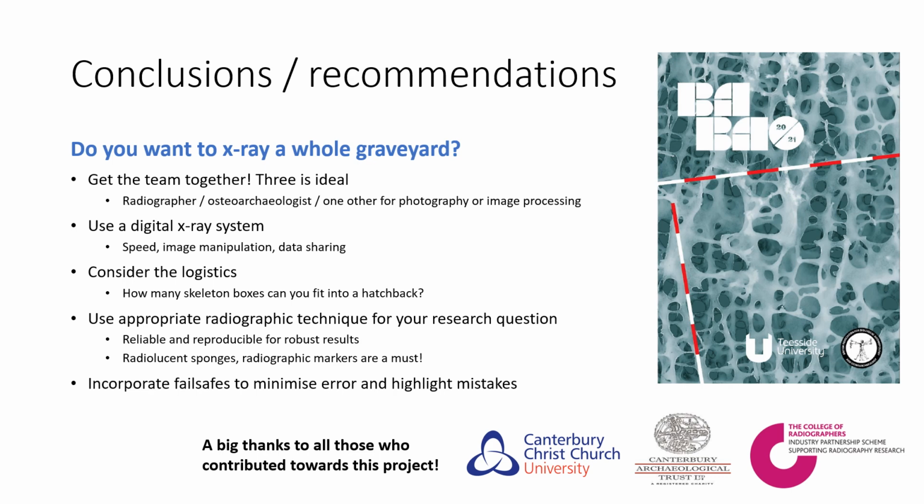Use a digital X-ray system. This is because of its speed, the ability to manipulate the images easily, and data sharing. You can export and send it via the internet. Consider the logistics. How many skeleton boxes can you fit into a hatchback or whatever vehicle you have available to get it from where it's been stored to the X-ray room and then back again?